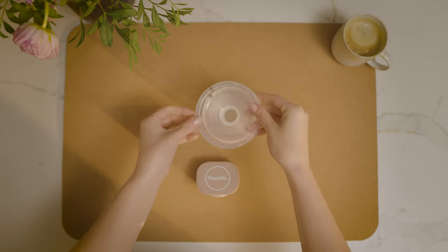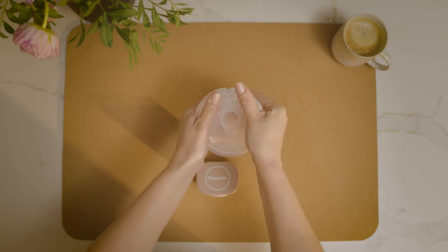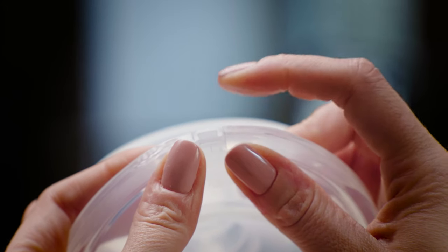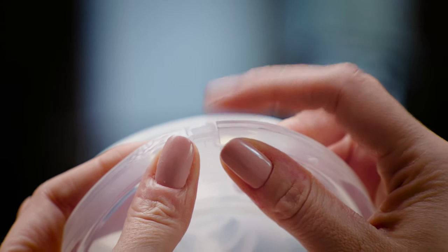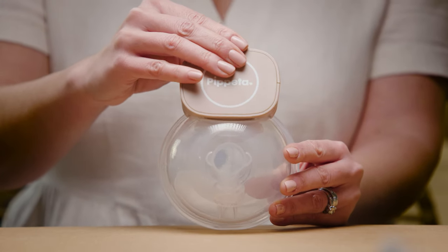Fit the flange breast shield to the collecting cup, ensuring the pouring holes are aligned. Finally, fit the motor on the top of the collector by pushing into place.